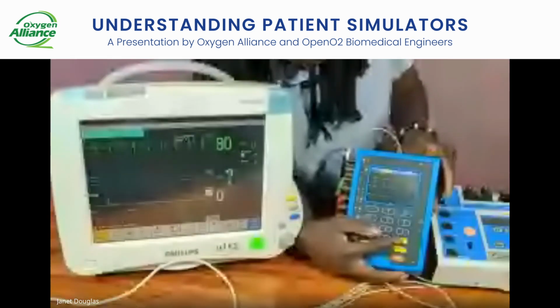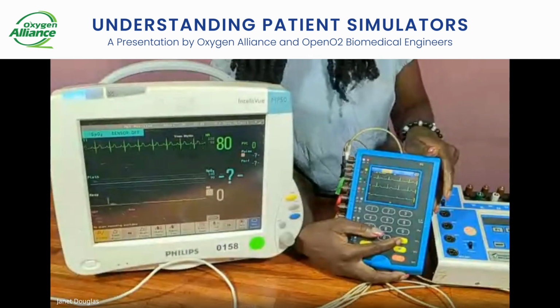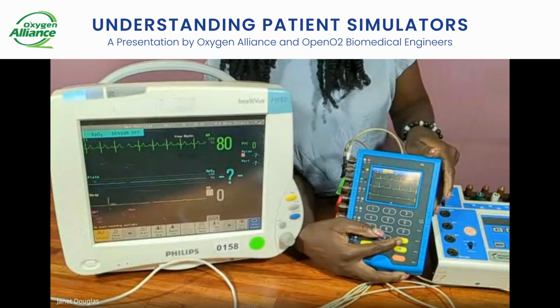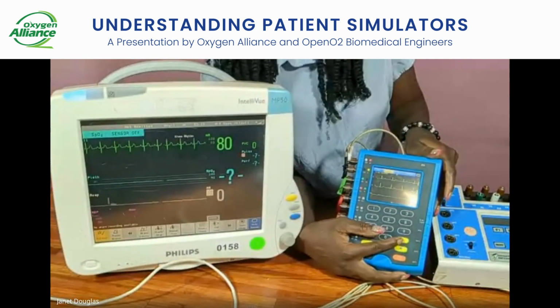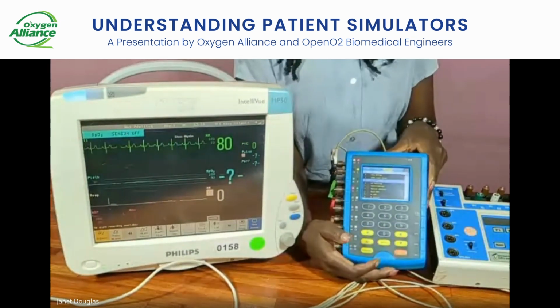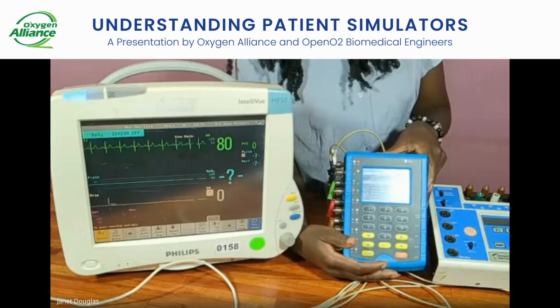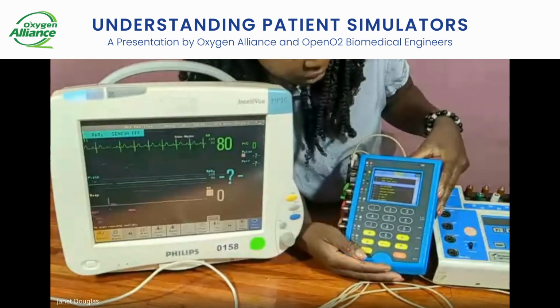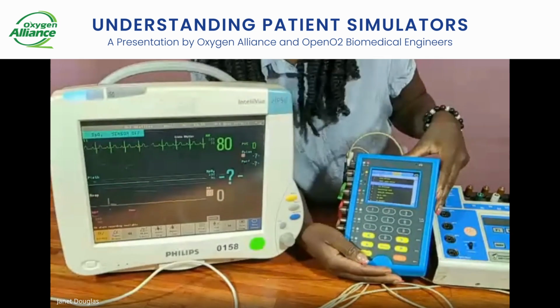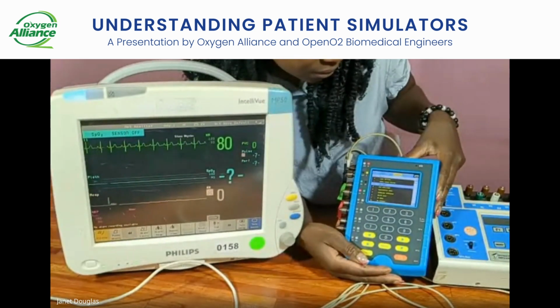So there's a tab for wave, whereby it's going to show me the waves that are being generated when I've connected my ECG. And on the list, that's where it acts as our simulation. You find a list of things that you can simulate. These things are given numbers, because when you check on number 1, you can see that there are few settings.